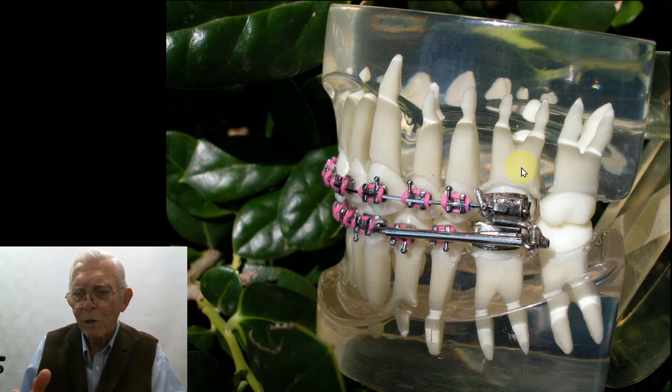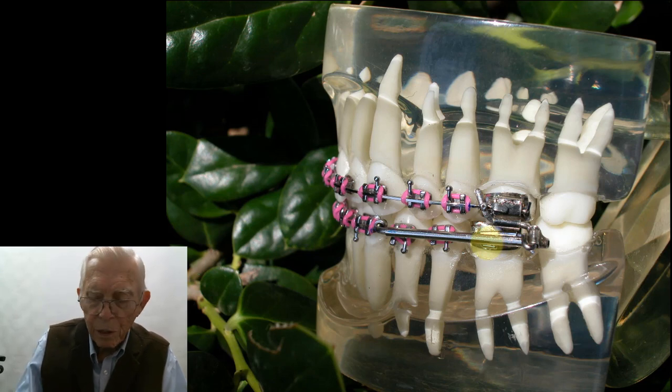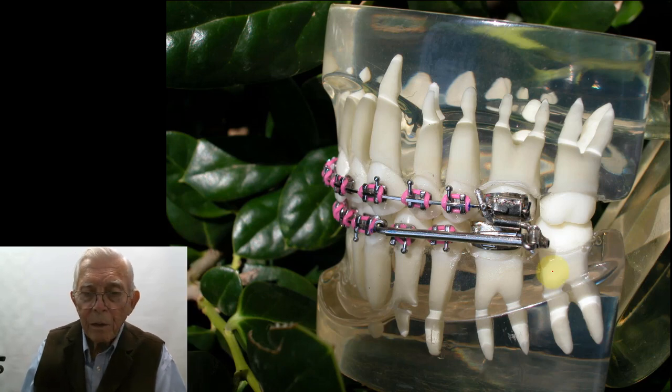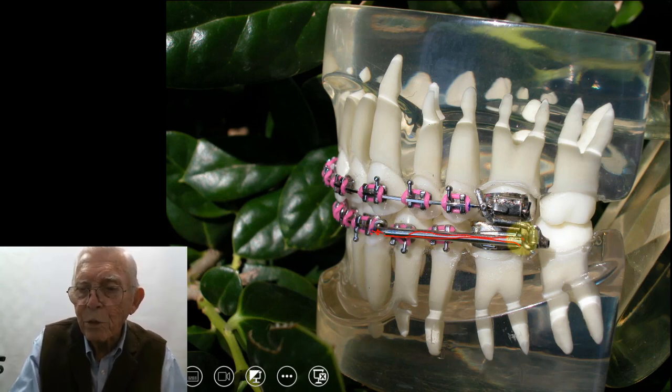I went and took a course on the Herbst appliance, and I took a picture of the type they were using and just showed it. This is a neat piece of machinery. This is a tube coming across here. This portion is a tube, and then you have a heavy rod that goes inside this tube.